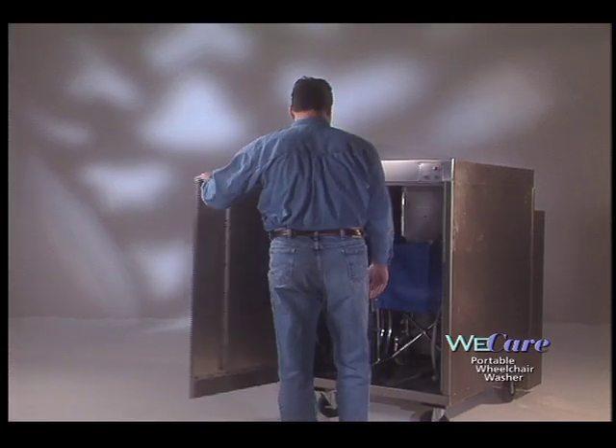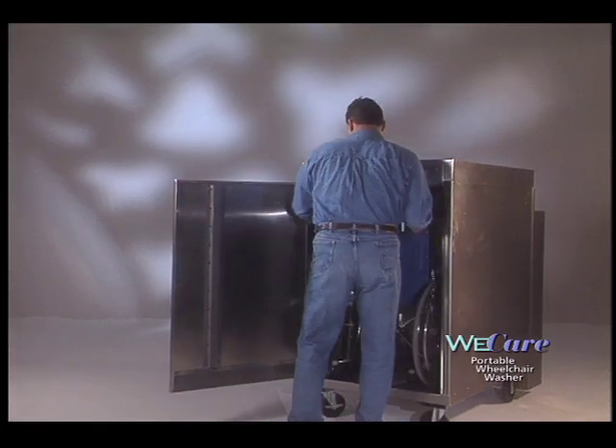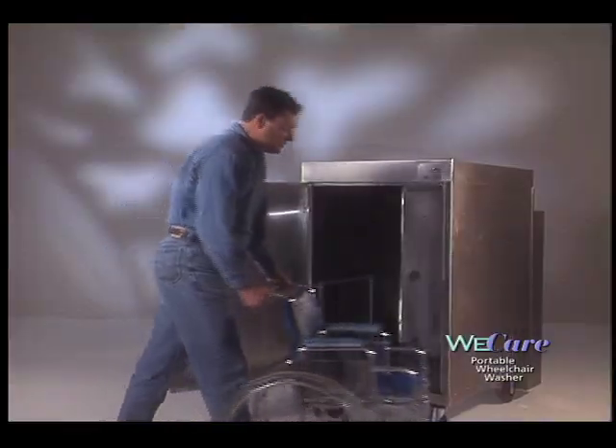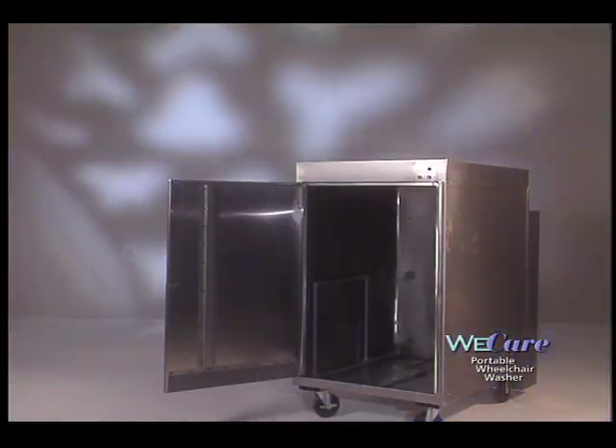The WeCare Portable Wheelchair Washer thoroughly cleans and disinfects, cuts labor time dramatically, and eliminates bacteria and odor. It is easy to use, and best of all, it saves you money.